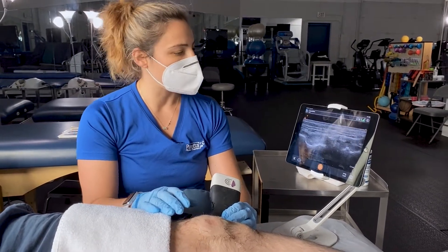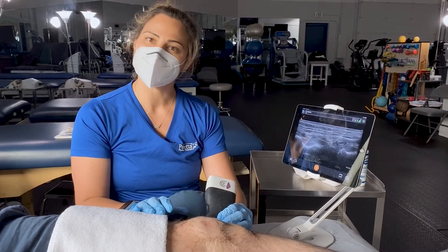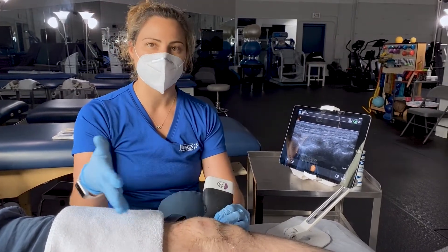This is called musculoskeletal diagnostic ultrasound, and we are doing a knee exam today.